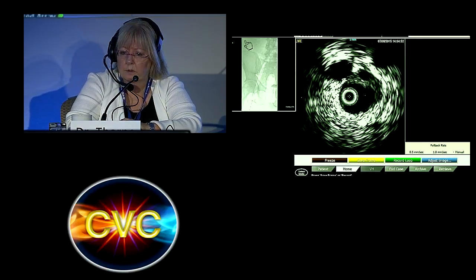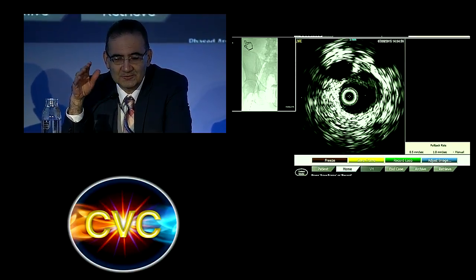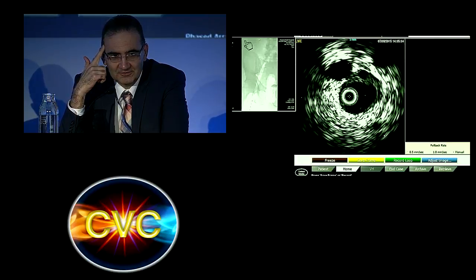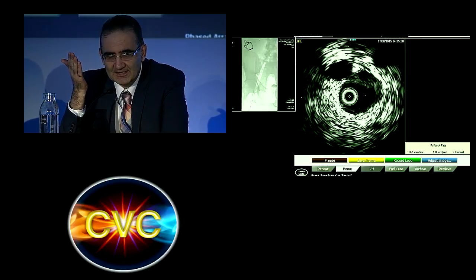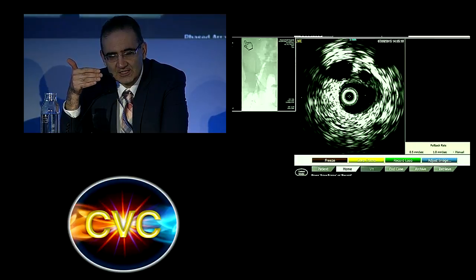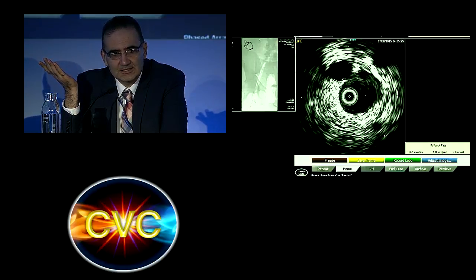Yeah, I just want to make a comment to avoid any nomenclature mistakes. We do not use the term superficial femoral vein anymore because we are talking about deep venous system and just femoral vein would suffice. Second thing is stenting starting because, as Patty said, there is external iliac vein stenosis, but not more cephalad. So if you cover the external iliac vein and then extend your stent into the common femoral vein more caudally and cover the second lesion, that's a perfectly acceptable approach.